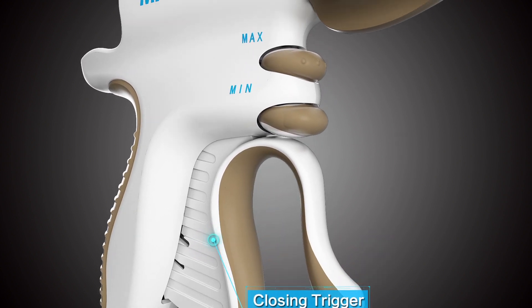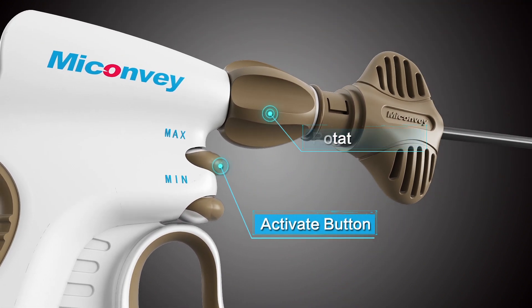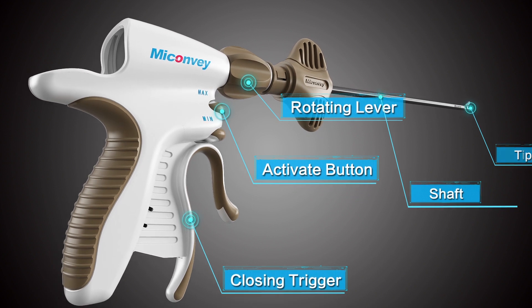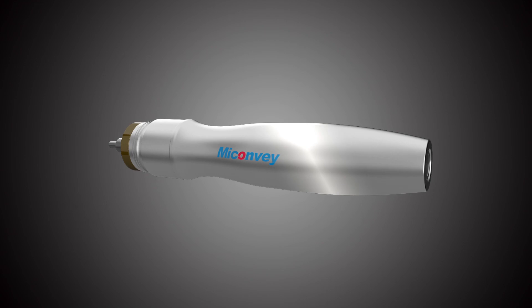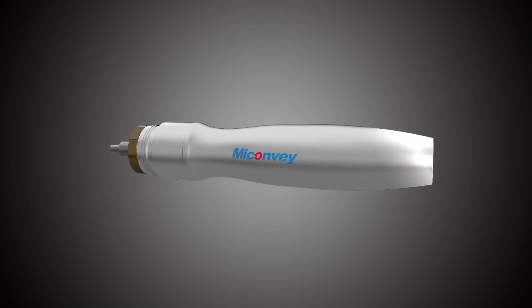The shear is composed by a closing trigger, activate button, rotating lever, shaft, and tip of the shear. The handpiece is an important component that connects the shear to the generator to complete signal transmission.